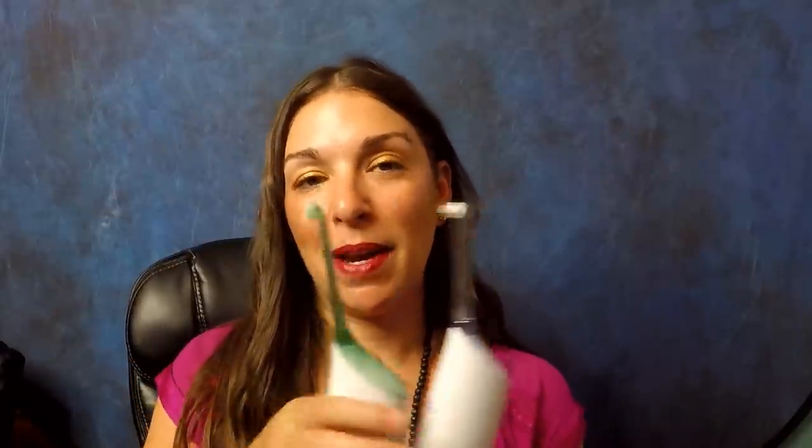Hey guys, I'm making you this video today because I wanted to give a side-by-side comparison of the Sonicare flosser versus the Waterpik water flosser. Now you may be confused because if you're buying online or buying in the store, the Sonicare brand is called Air Flossing and the Waterpik brand is called Water Flossing.